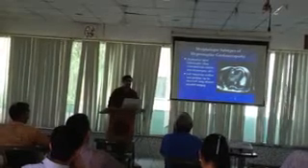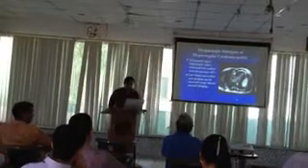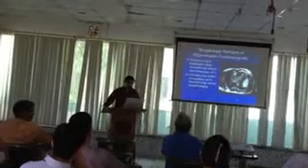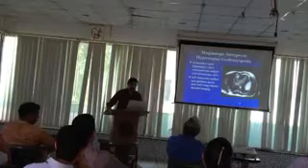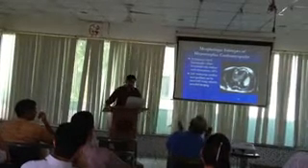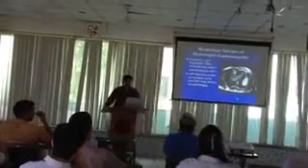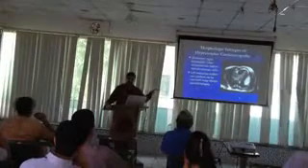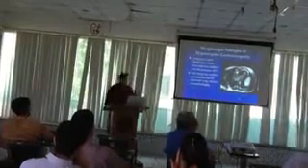With hypertension, and the MRI says a different picture. So this is deceptive. This is not true cardiac hypertrophy. What we are measuring or recording actually is because there is a contraction of the cavity inside itself. You feel a deceptive hypertrophy, so that we overestimate the cardiac hypertrophy, and you don't visualize the wall pattern, whether there is fibrosis. So MRI scores over echo. Absolutely.